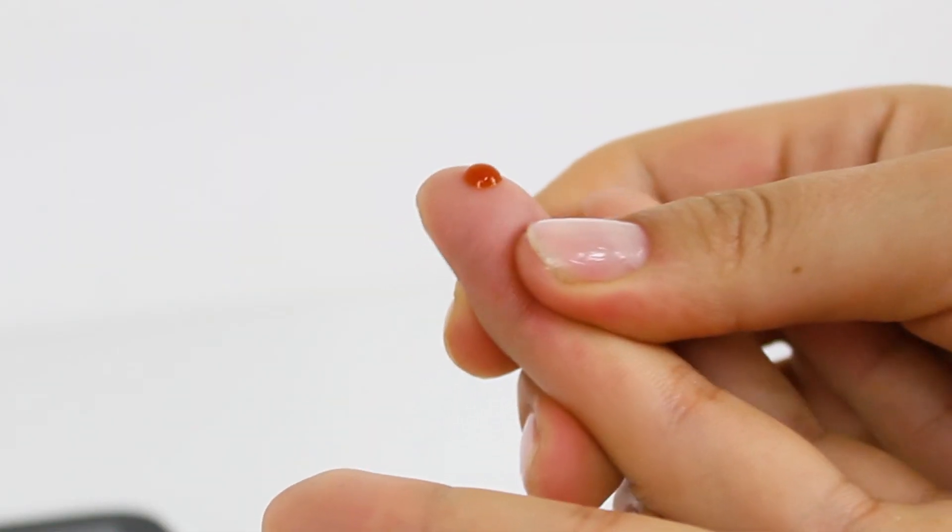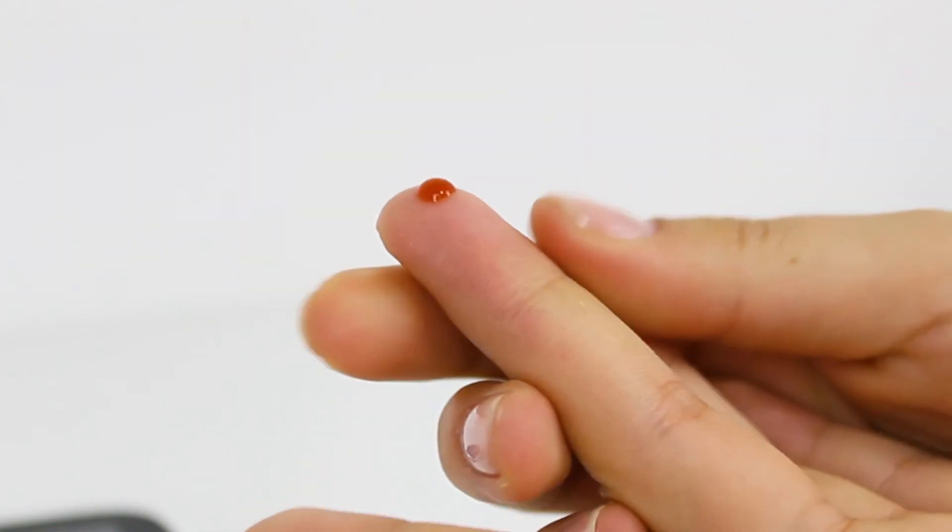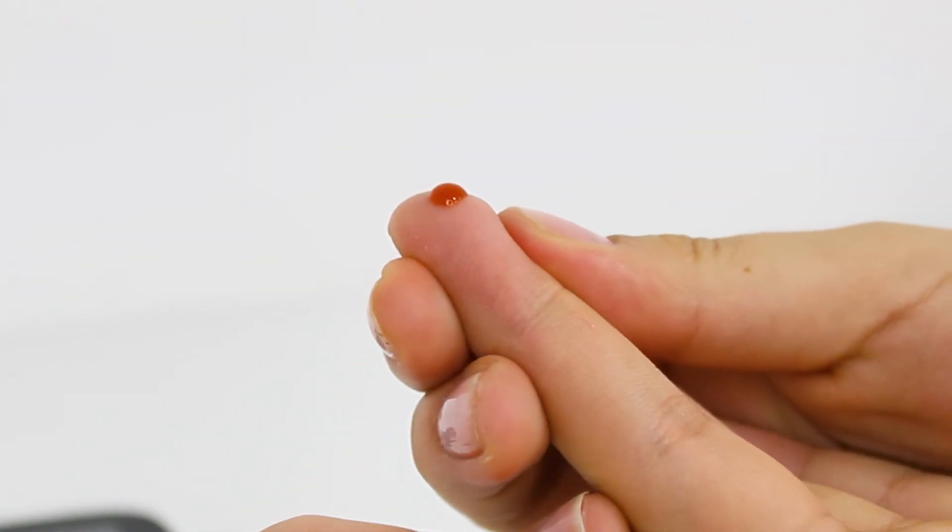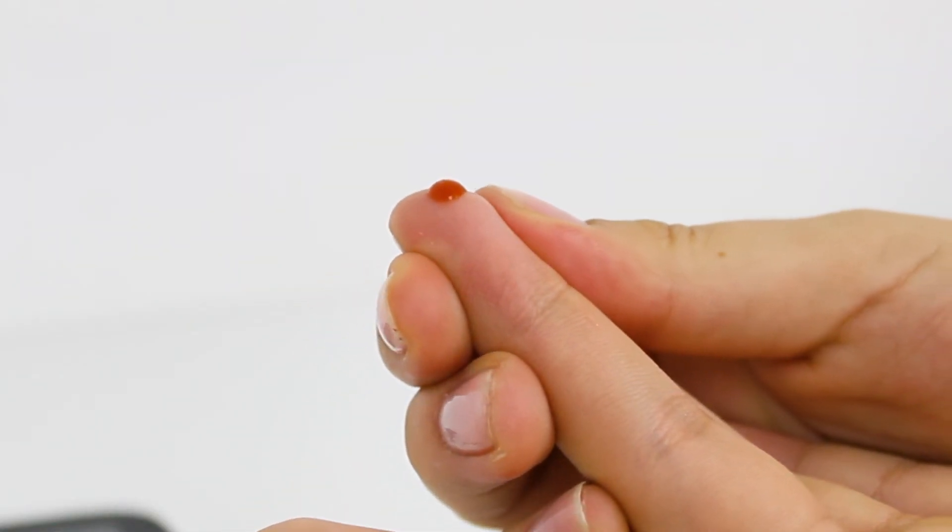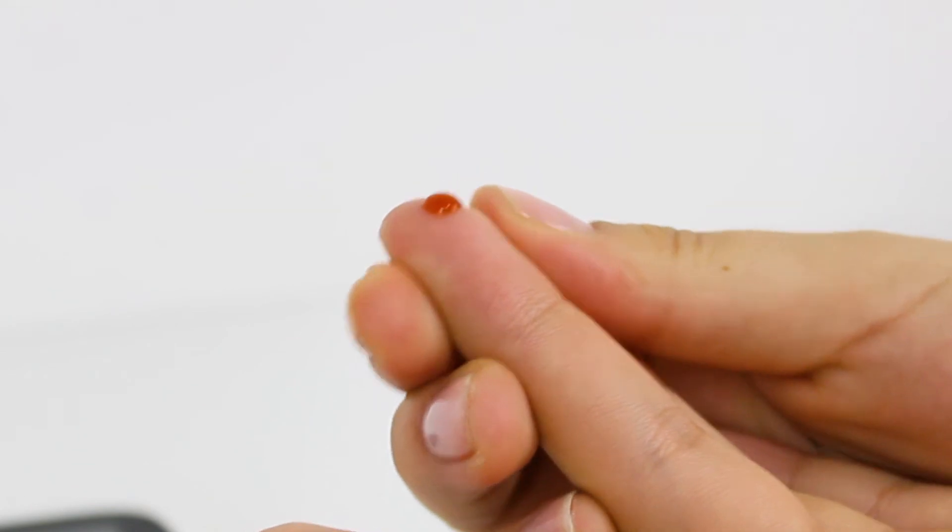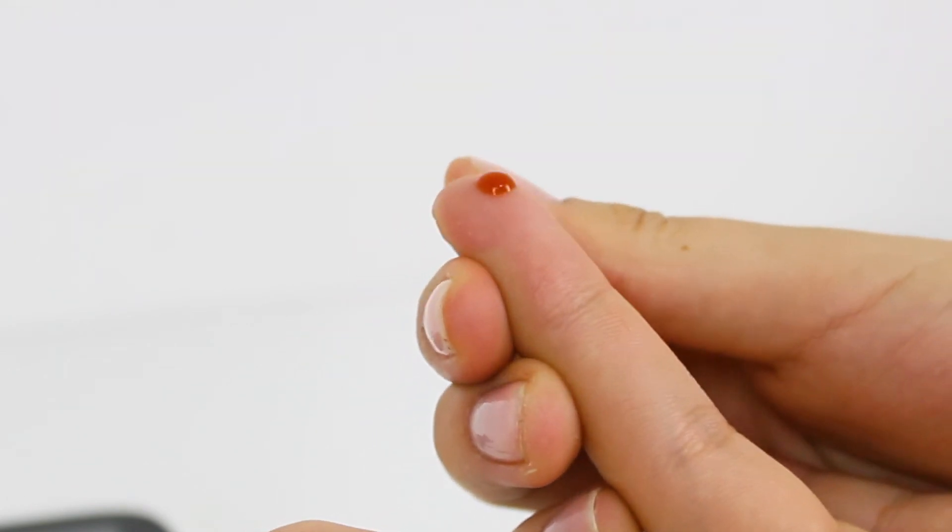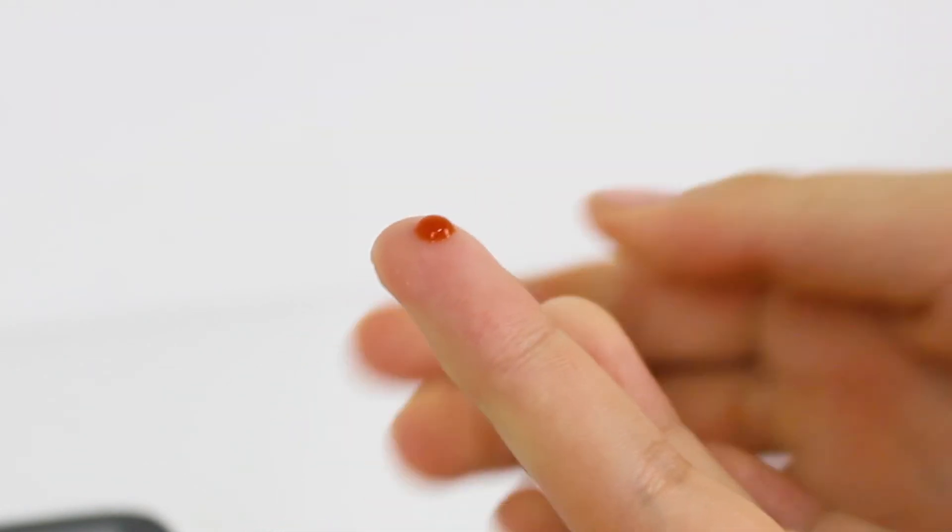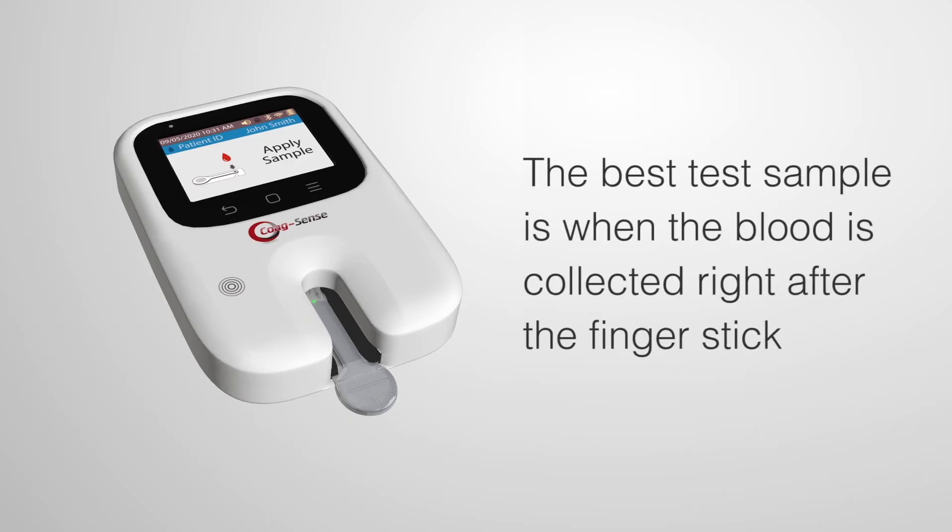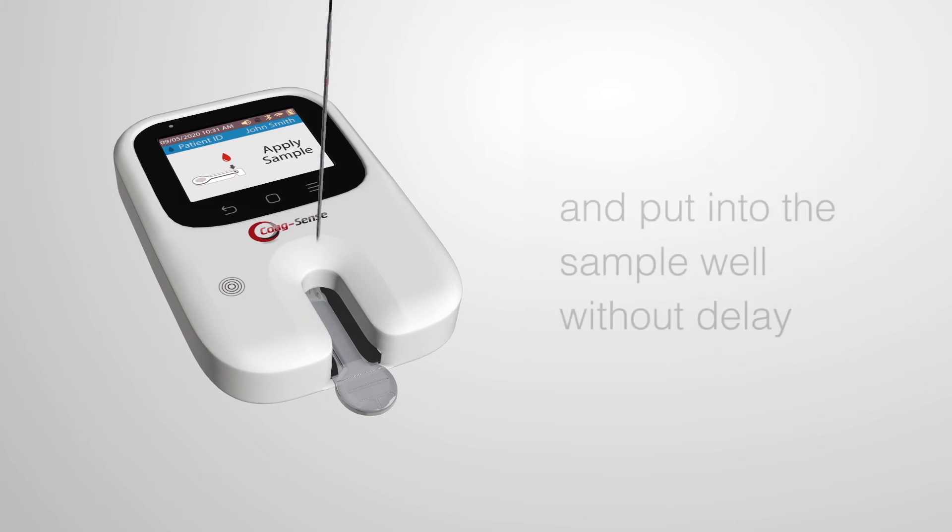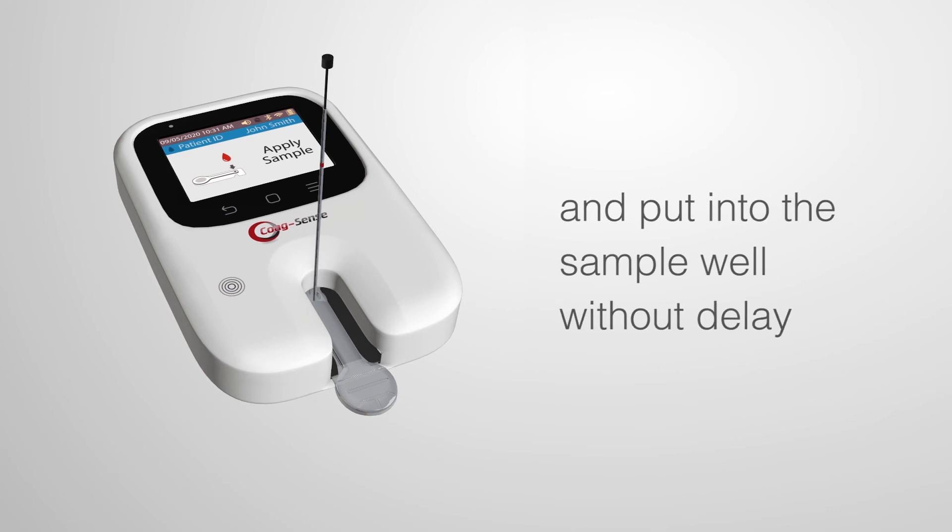Apply pressure above the joint and gently squeeze the finger from the side using your thumb and index finger from your other hand. The best test sample is when the blood is collected right after the finger stick and put into the sample well without delay.